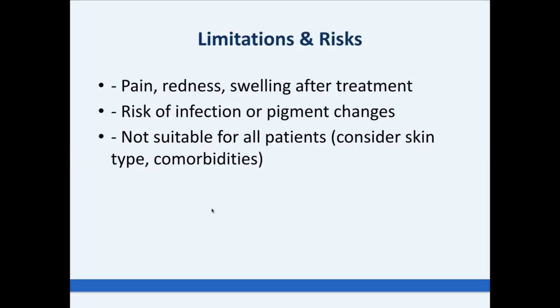Yes, some limitation. I think maybe Dr. Jeff said about that a little bit earlier, but we have some pain, redness, swelling after treatment. Risk of infection is not very big, but it is, and pigment changes. So we try not to use CO₂ laser in summertime, especially on the face, wrists, or some visible areas. Yes, for sun, or we discuss with the patient about SPF 50 plus sun protection factor.